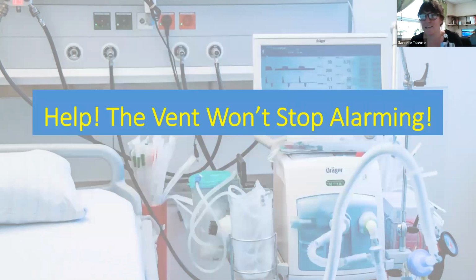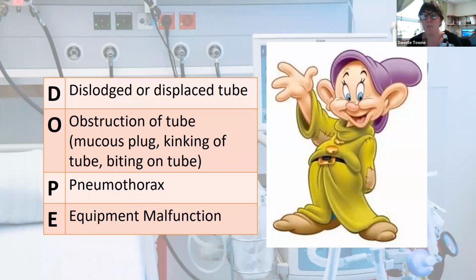Okay, so let's say my vent's not stopping alarming and nobody's around, what do I do? The DOPE mnemonic helps you to remember the most common causes and complications of post-intubation hypoxia or deterioration.